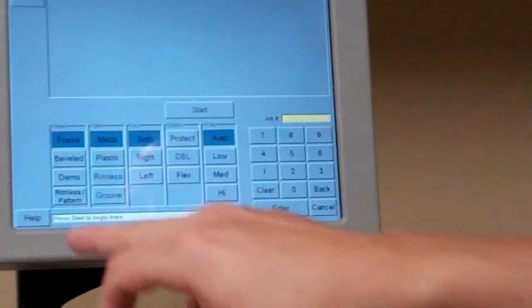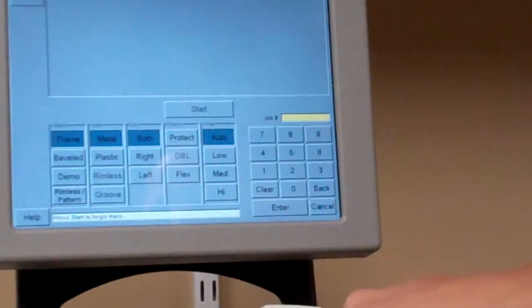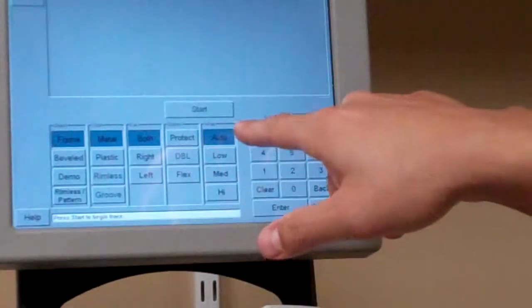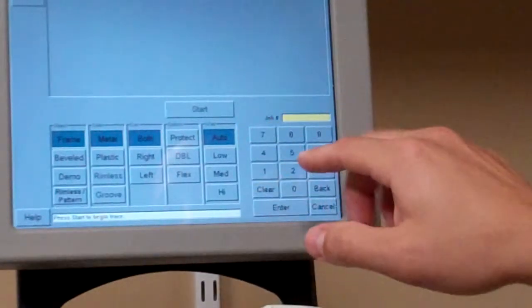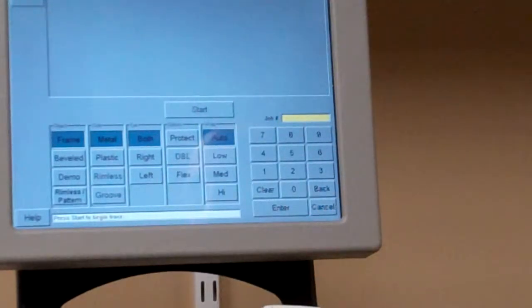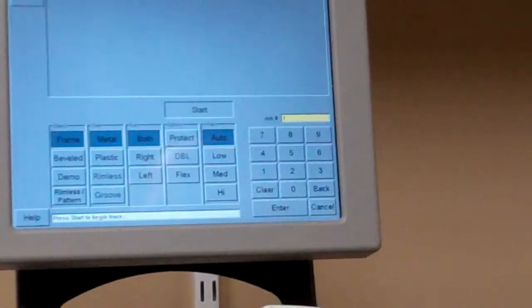Obviously it's a metal frame. We're going to trace both eyes. It's not a flex frame — it's just a standard frame — so we'll leave that alone. For wrap, I like to always leave it on auto; I don't ever change it for anything. Then you want to go ahead and put in your job number and tray number, however you keep things sorted in your lab. I'm just going to use number one, and then you hit start.